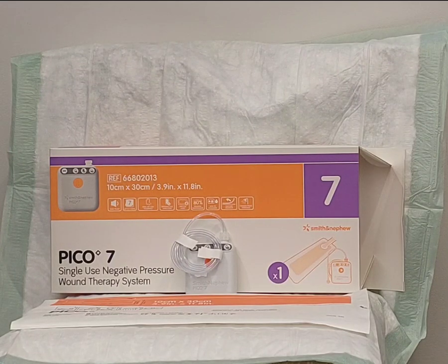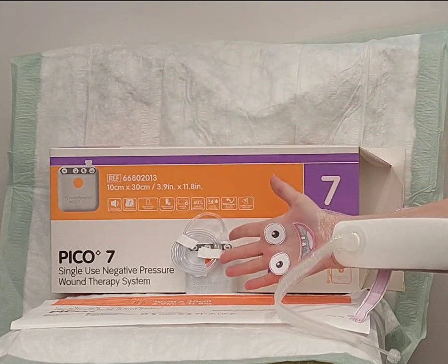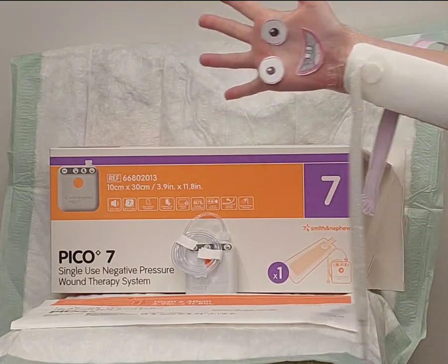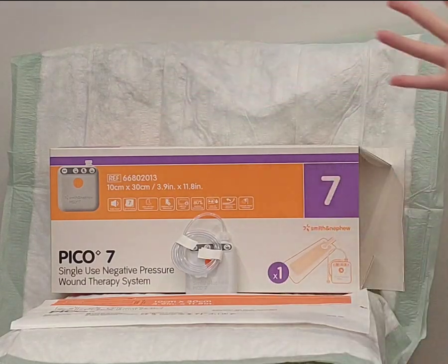Pico dressings are a type of single-use negative pressure wound therapy. They apply negative pressure at 80 millimeters of mercury evenly across the dressing through a wee pump. They can manage a moderate amount of exudate by absorption into the dressing and through evaporation of moisture through the outer semi-permeable film. Pico dressings are indicated for use in a variety of acute and chronic wounds.